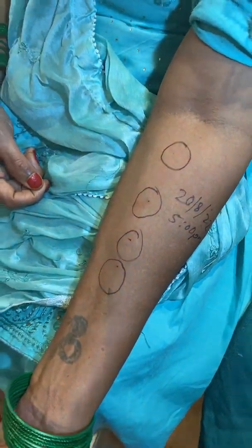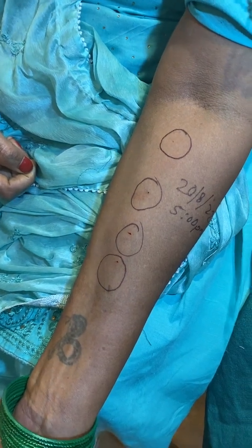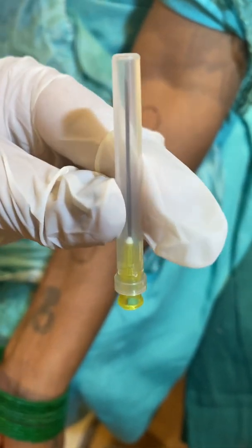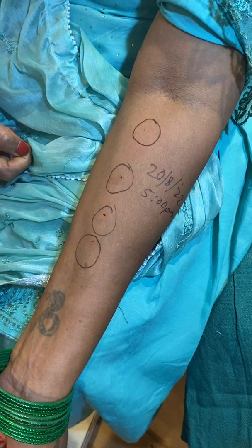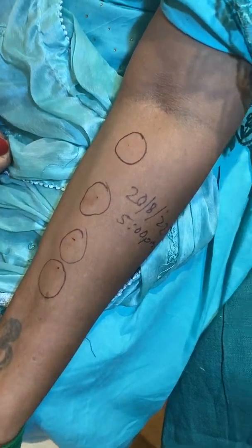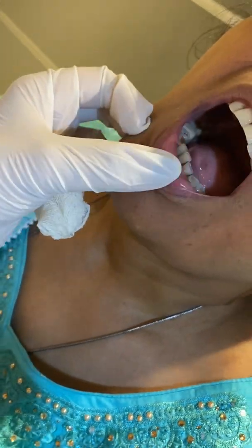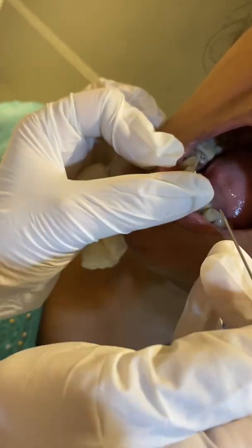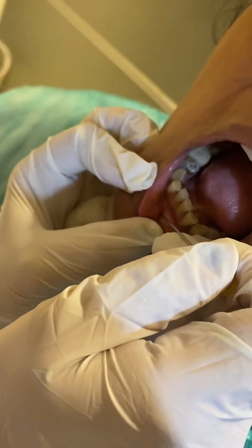We have to do it over the mucosal area of the lip. With the help of a 20 gauge sterile needle, we are going to make a small prick in the mucosal area of the lower lip.